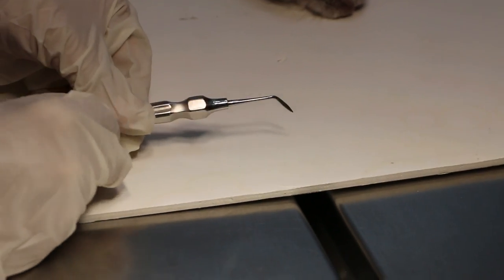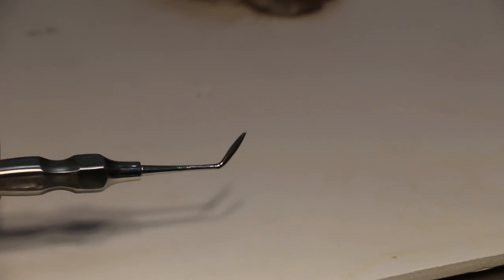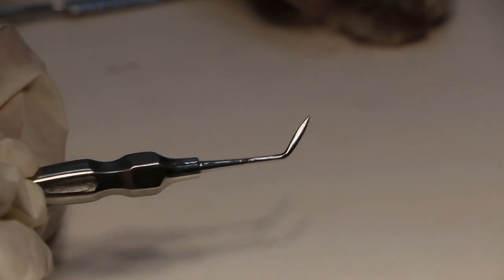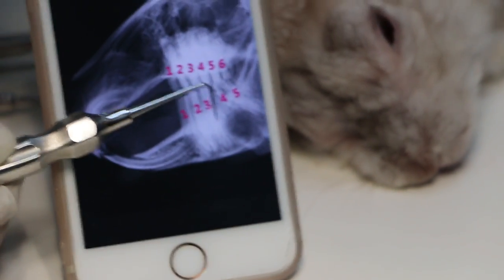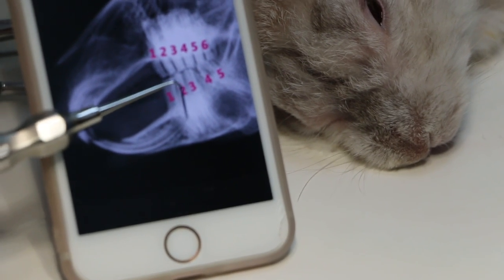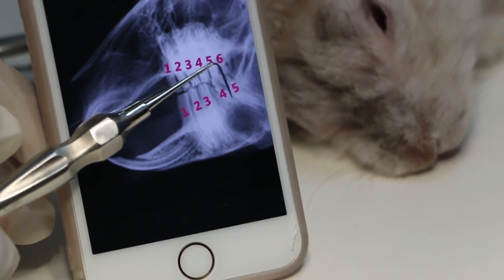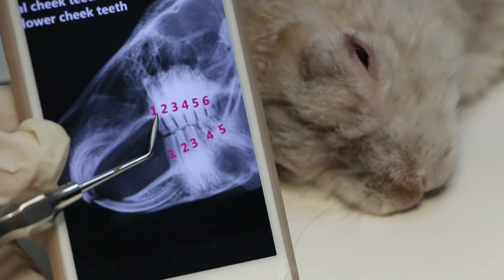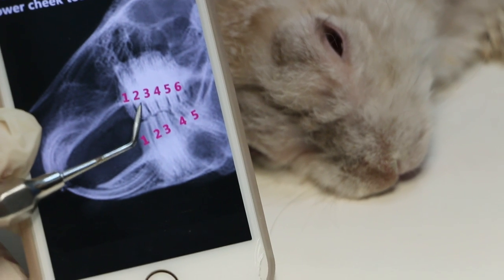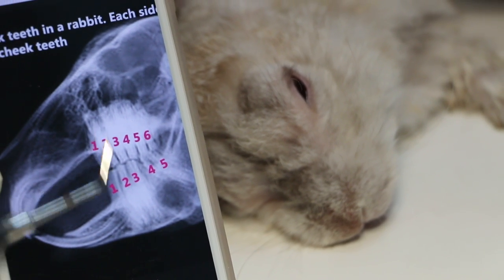To summarize: the molar luxator goes inside the mouth and breaks down the ligament between the gum and the root so the tooth can be loosened and extracted. The ligament is very strong in a normal tooth. For the upper cheek tooth, you go under the gum to loosen the ligament that binds the tooth solidly in place.